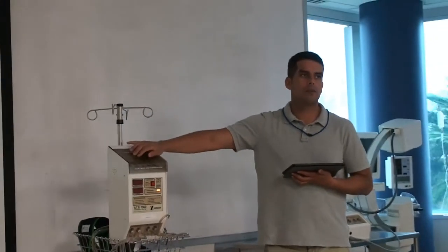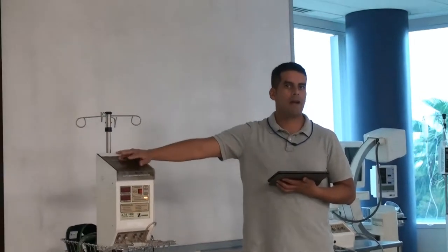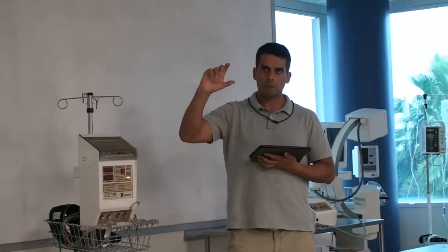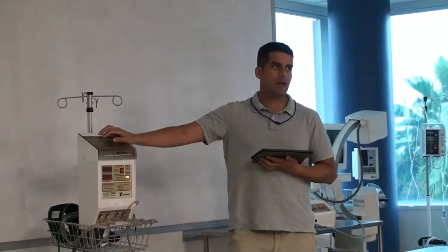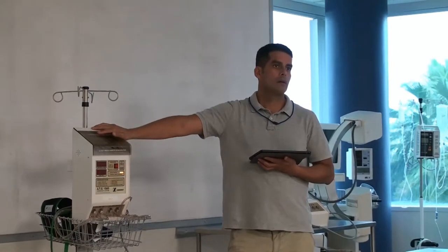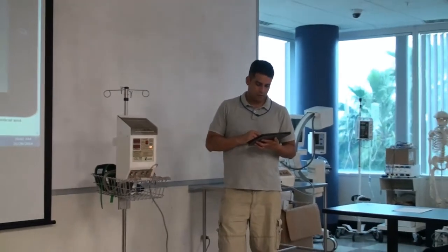It's very accurate, because after you set up the pressure, the unit has plus or minus 5 millimeters mercury of difference in the pressure that you apply. And when you calibrate, the manufacturer suggests plus or minus 6 millimeters mercury during the calibration process, just to have more accuracy during your surgical procedures.